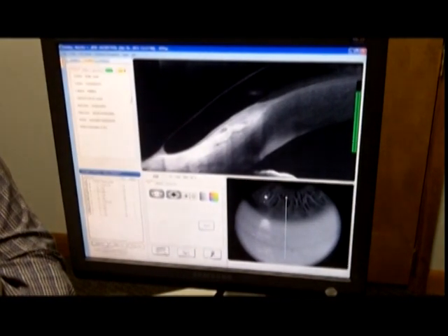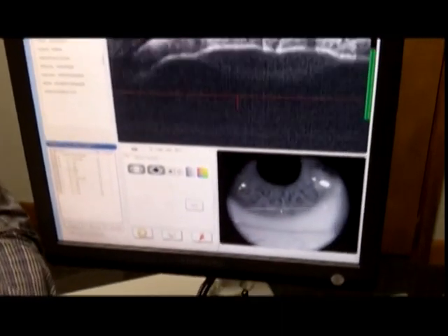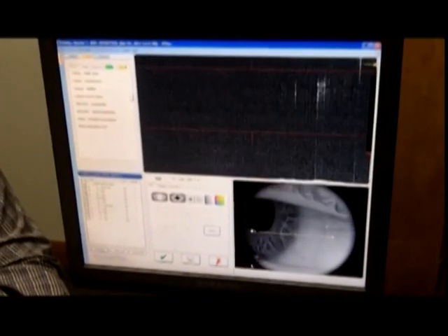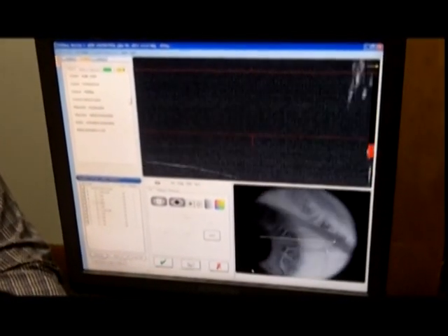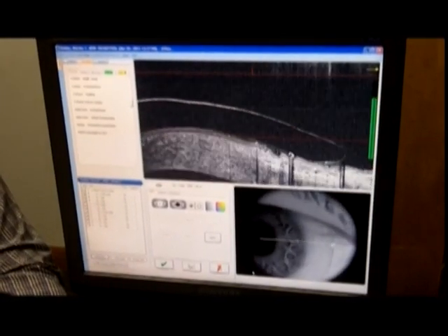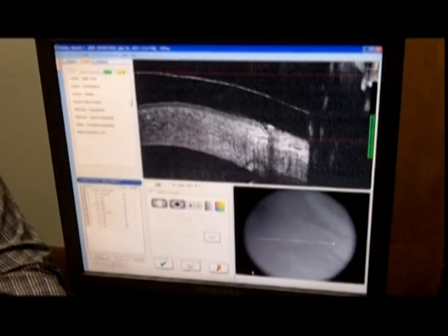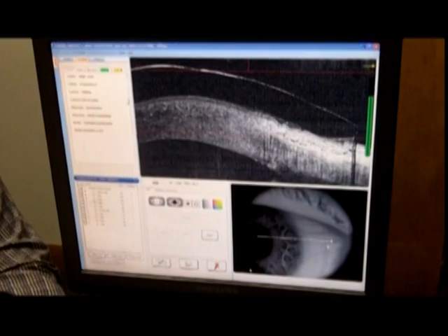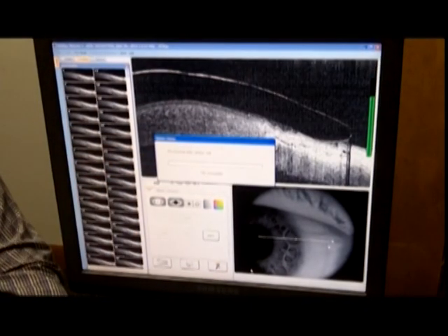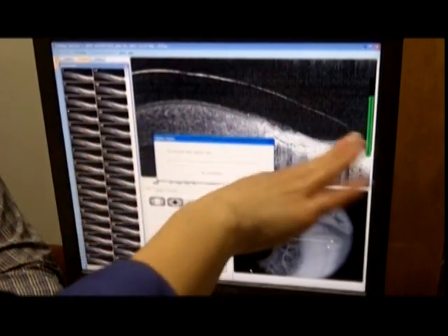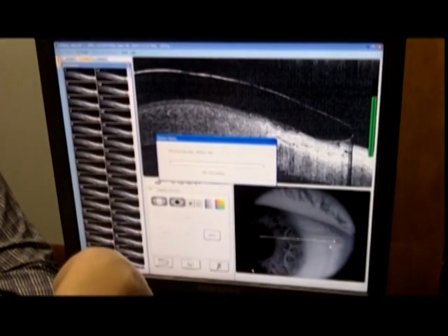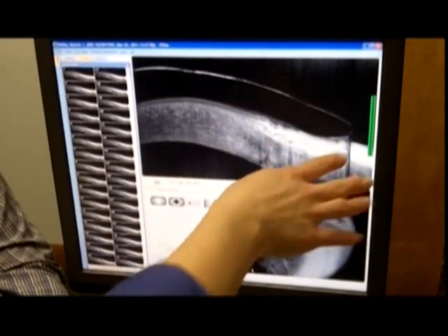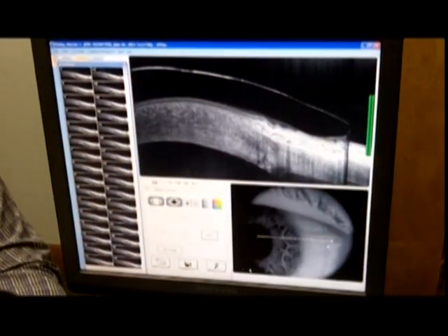Next we're going to have the patient look to the right so I can look nasally at the fitting of the lens. Look back a little — not quite so much to the right. Now we see a little bit of edge lift there. It's going to process the image and take the grainy look and make it higher contrast. It's a good image — we can see where it's sitting, we can see the limbus, we can see the sclera. The lens is visible. It's not too dark. You can see what I'm shooting.